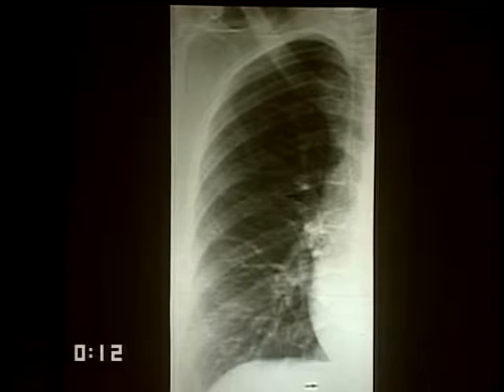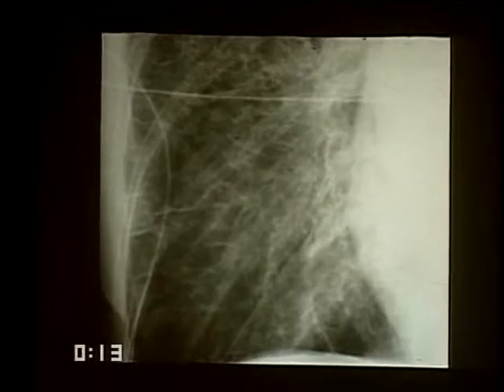It should be realized, every radiologist needs to realize, that most of the time, most patients, if given adequate instruction and time to execute the instruction, will breathe in to very close to total lung capacity and do so reproducibly. There's very little variation in the standard upright PA chest X-ray volume if the patient cooperates and the technologist fires the exposure at the right time.